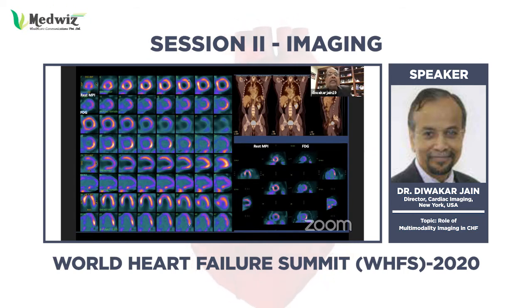amyloidosis. Now, another area is sarcoidosis. Sarcoidosis is an inflammatory condition, and this is an example of a 45-year-old male patient who had systolic heart failure with ejection fraction of 35% for the last 2 years, and the heart failure was progressively worsening. And this is a combined imaging, myocardial perfusion obtained with rubidium, and the second row shows FDG by PET-CT imaging.